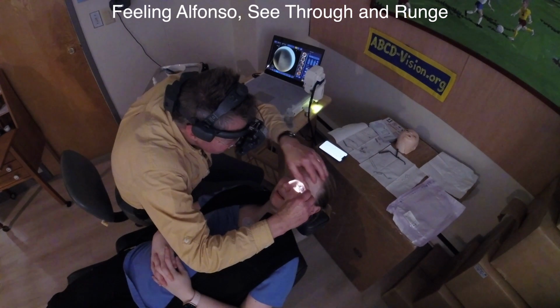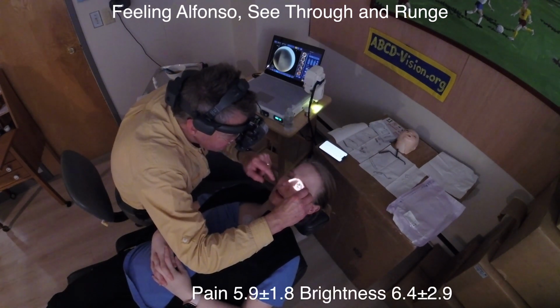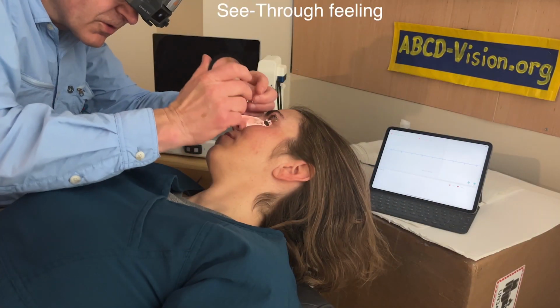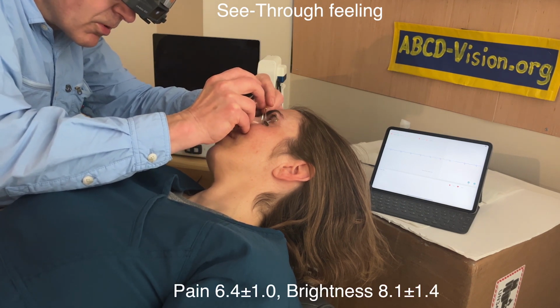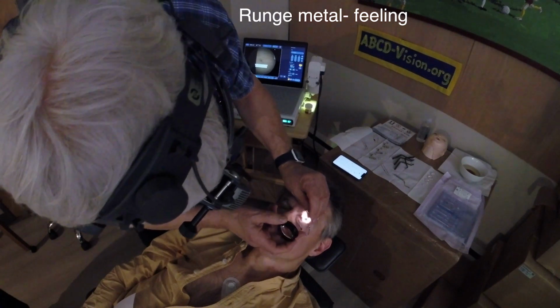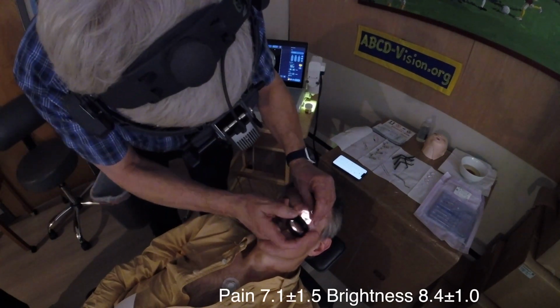And the Alfonso with the feeling eye. That is like an 8.5. This is the see-through. I'm going to slip mine in. And perfect. That's an 8. Oh, really? 8. Huh. And look to the left.